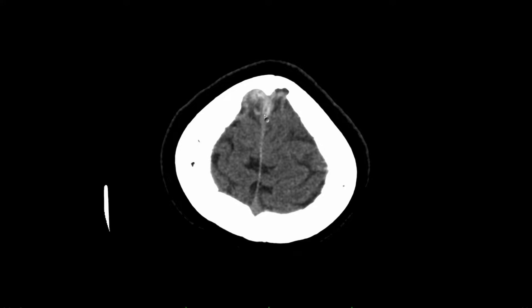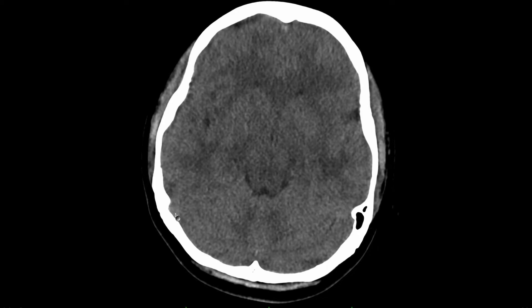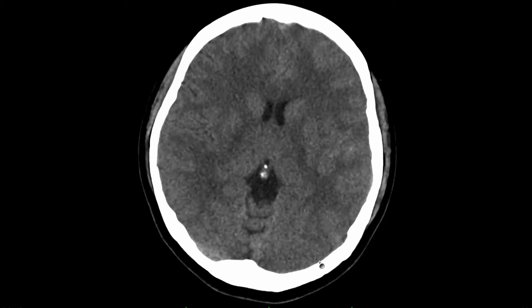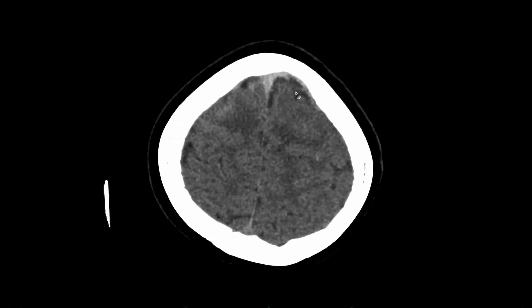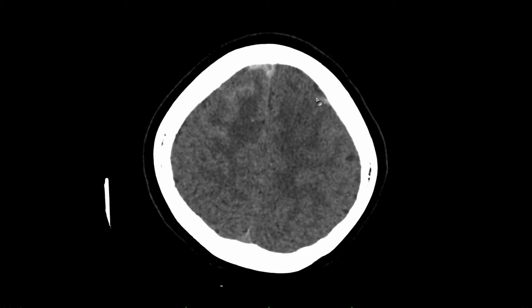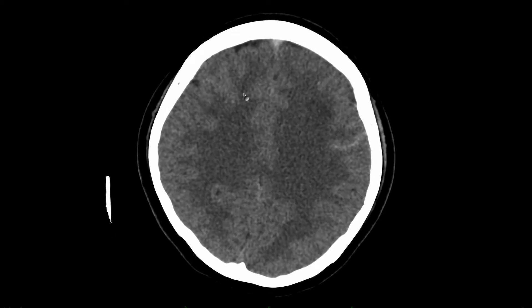The dural venous sinus here is expanded when compared with the posterior aspect of the superior sagittal sinus. Scrolling down, the transverse sinus is not dense and it's the same on both sides. High density also extends to the vessels crossing over the frontal lobes, more marked on the left. There is high density lining the sulci of the adjacent brain.